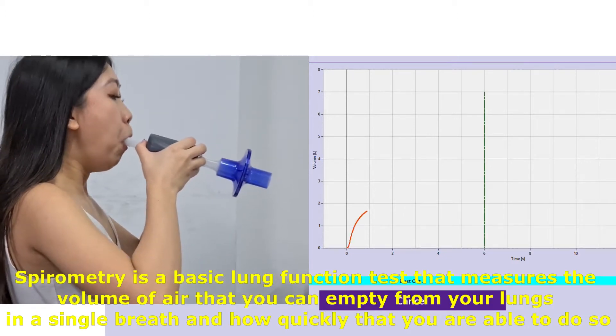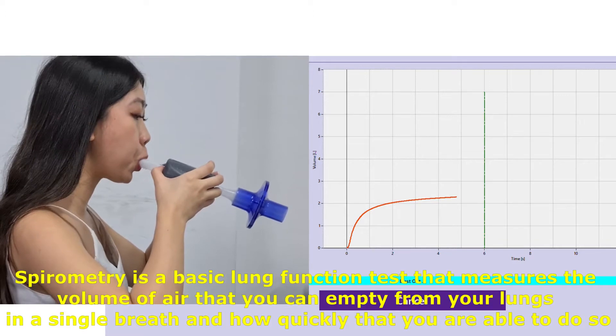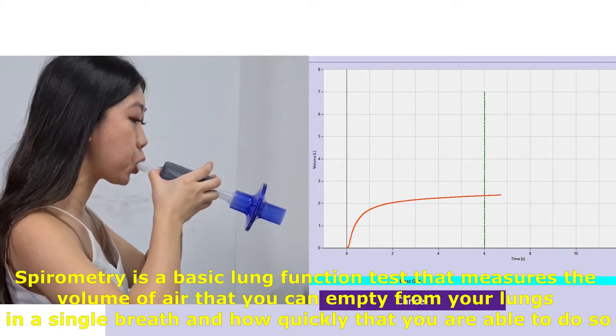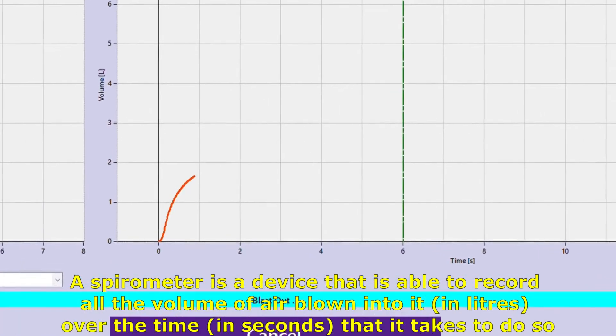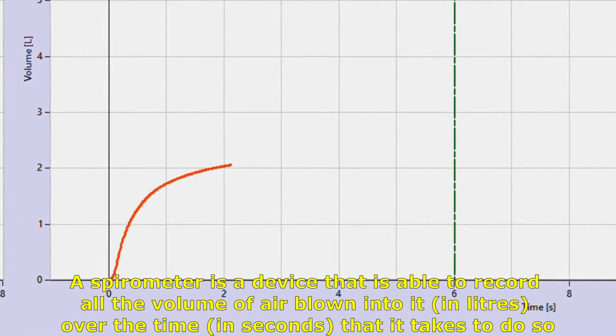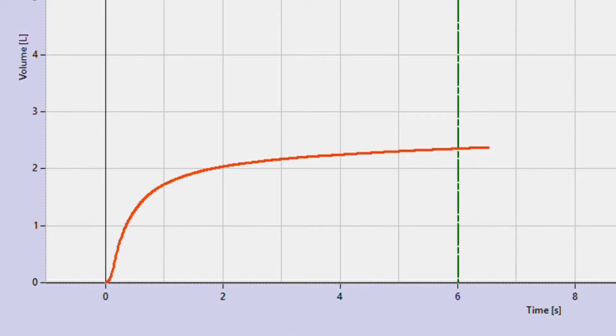Spirometry is a basic lung function test that measures the volume of air that you can empty from your lungs in a single breath and how quickly you are able to do so. A spirometer is a device that is able to record the volume of air blown into it, in litres, over the time, in seconds, that it takes to do so.